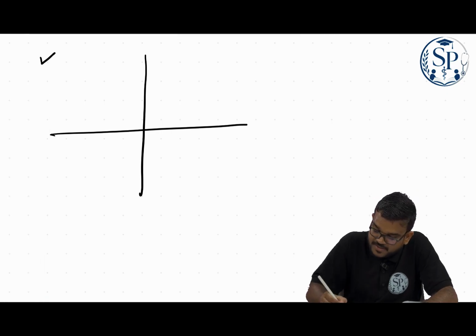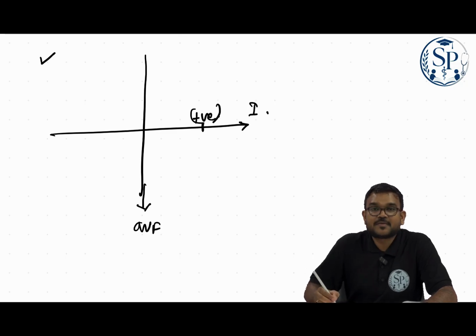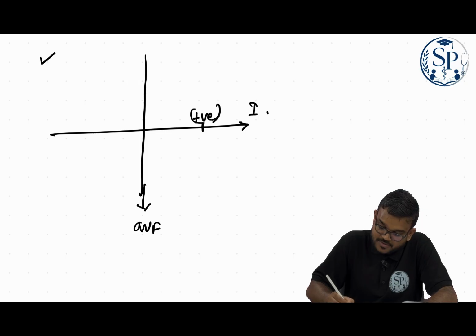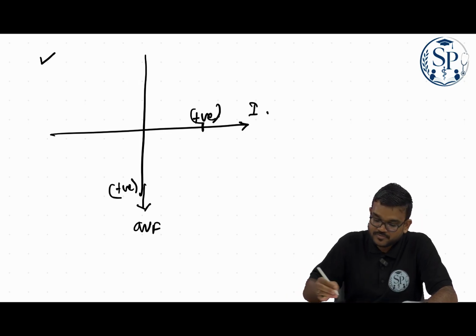If the R minus S in lead 1 is positive, the positive direction is this direction. In lead AVF the R minus S is also positive. So the resultant will fall in this direction, which is normal.